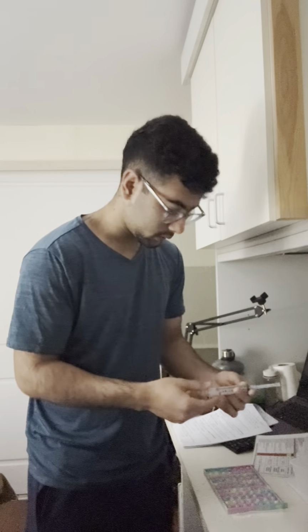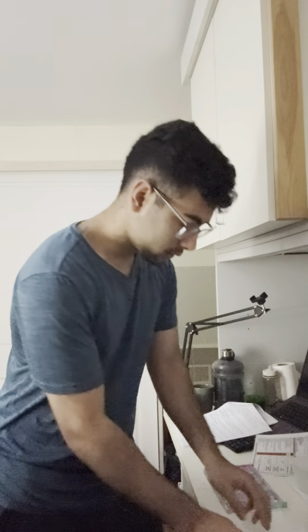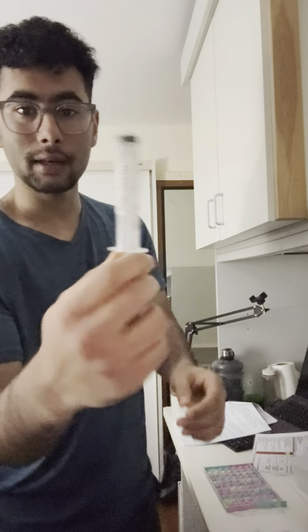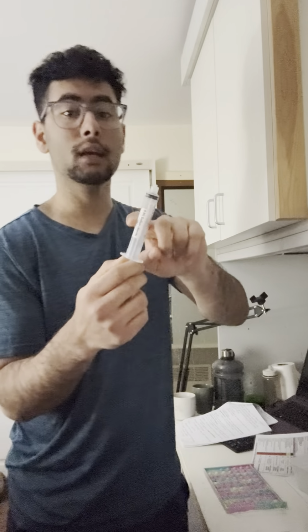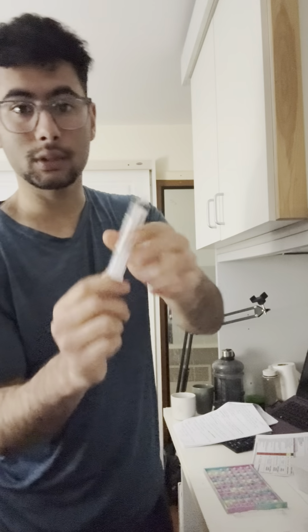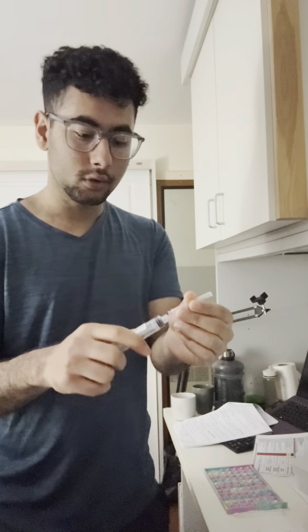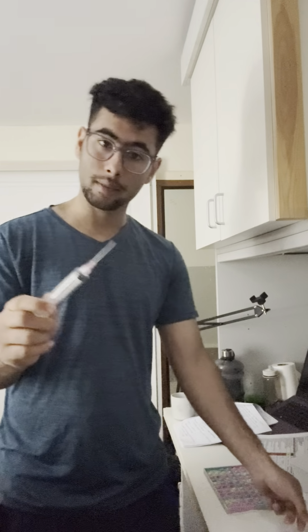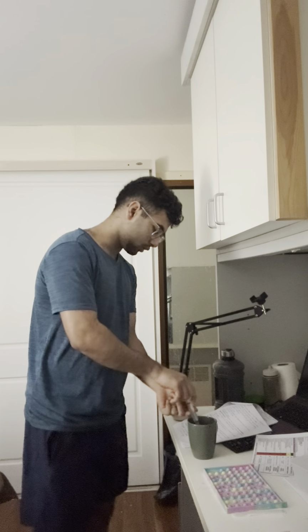Start with the saline. We need 3 10 ml saline, right? For example, I have these 3 saline, as you can see. You always need to label these with saline, which I already did. So how do we do it? Have a look. This is the 18 gauge drawing up needle, just to draw up from the plastic saline. You take it like this, using aseptic non-touch technique, right? For example, I don't have any kind of vial, so I'm going to draw some water, 10 ml from my cup of water. This is the saline, for example. I'm going to draw this up.